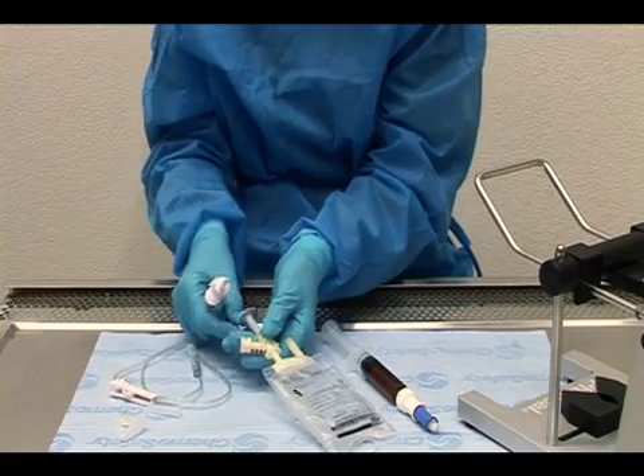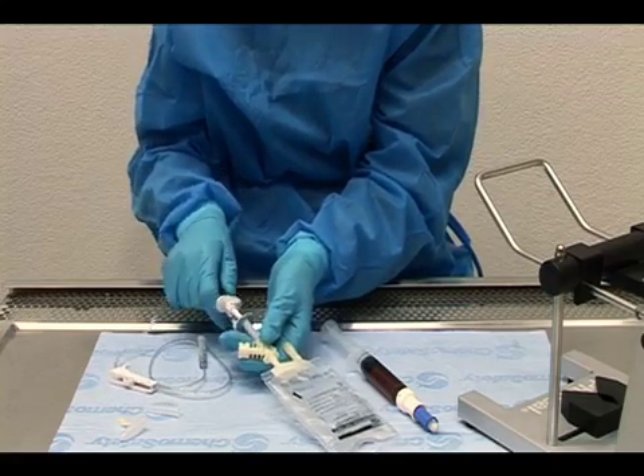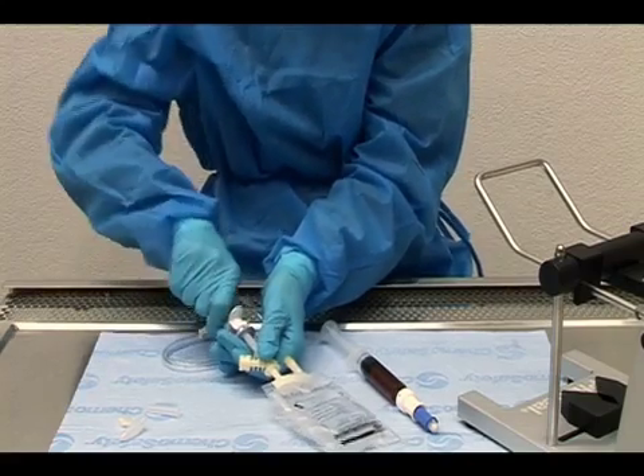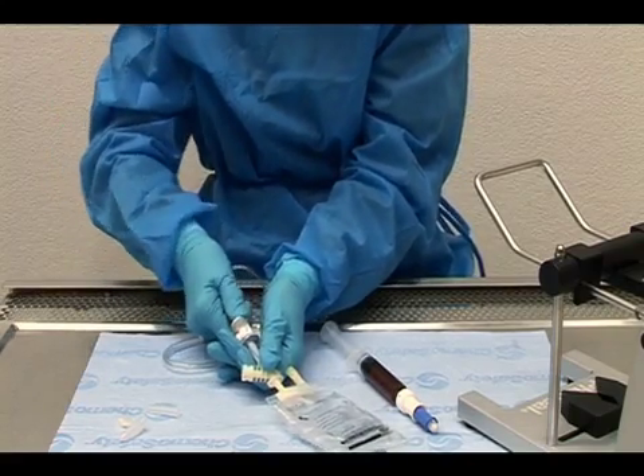Open the lid of the infusion adapter's distal blue end. Spike the infusion adapter with the tubing administration set, inserting it all the way into the infusion adapter's spike port.